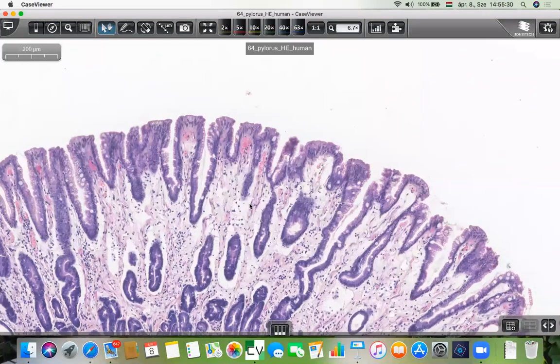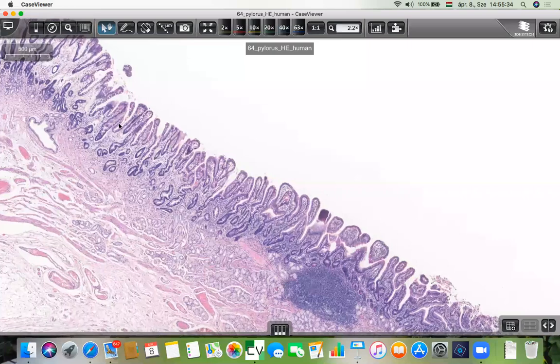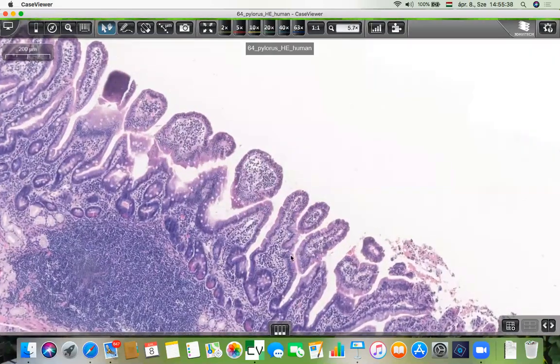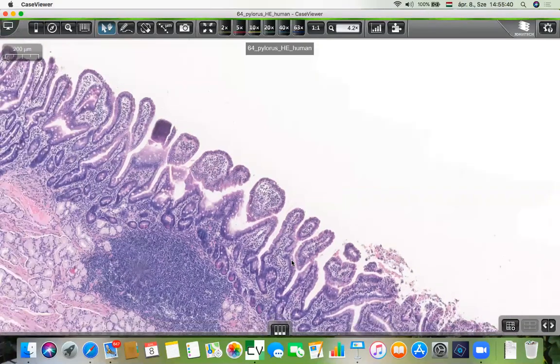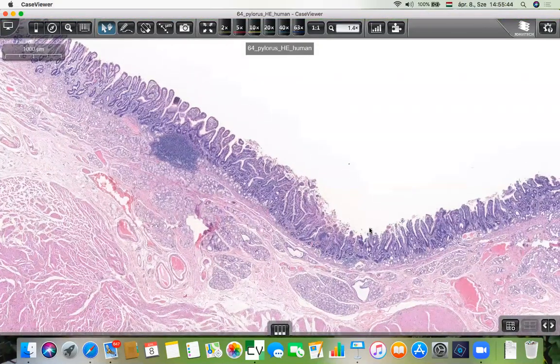Beautiful scene. And then, obviously, we have a transitional part. Here we can see the intestinal villi. We cannot see Kerckring folds, obviously because of the sphincter. So no typical submucosal folds, but villi are present.